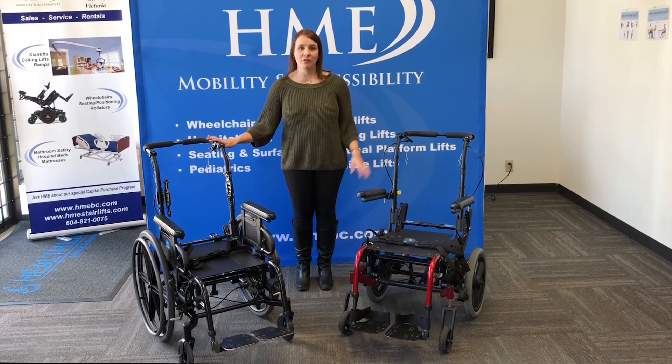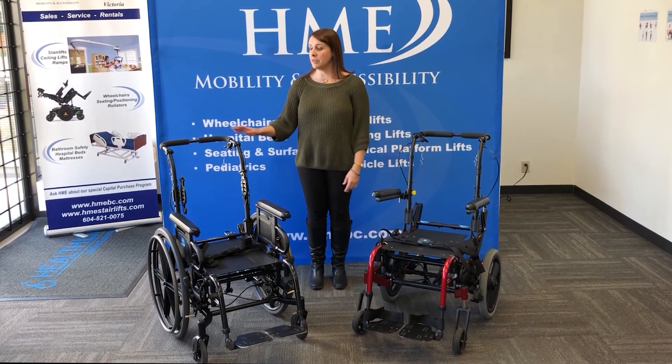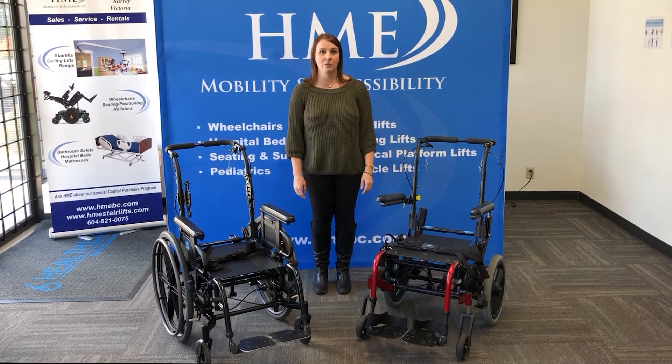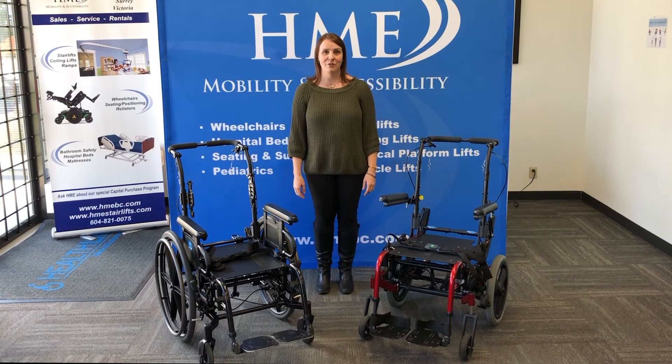The SR45 and the Iris are both great tilt-chair options. If your client is looking for something more basic, often the SR45 is going to be a great pick. And if you're looking for something where you have more complex needs, the Iris is also an excellent option. Thanks for joining us today, and if you have any questions, please contact your HME rep.